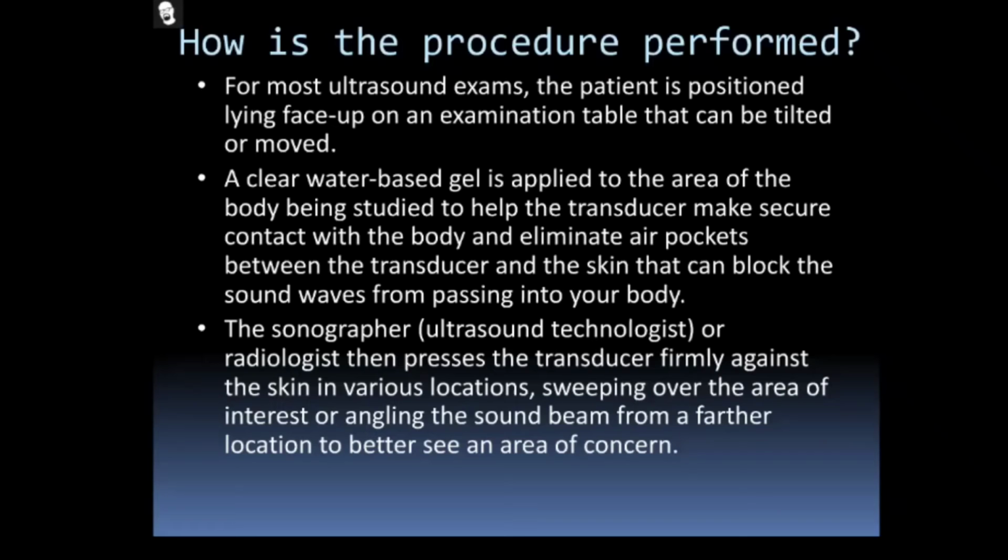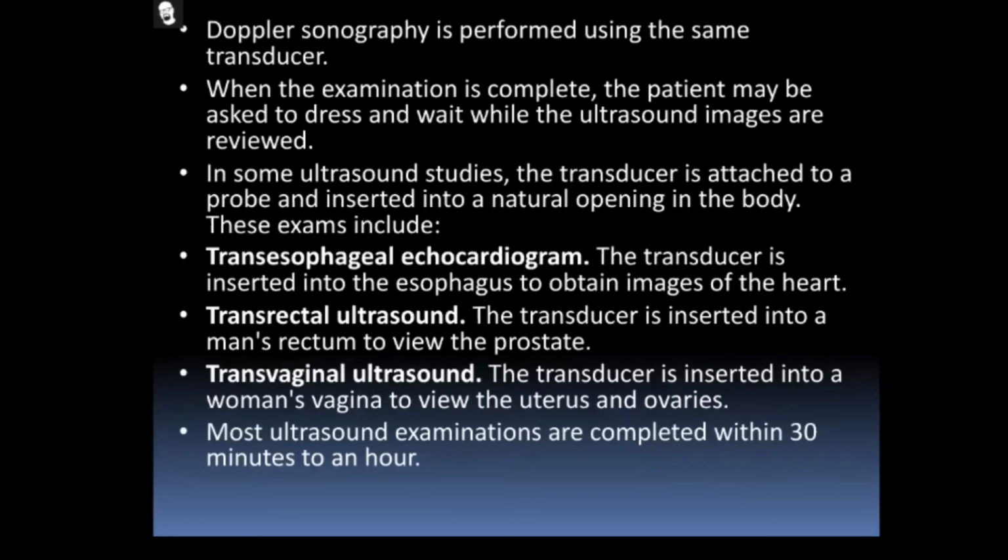Wherever the exact region you need, you need to keep the probe over that location. The probe can identify what internal organ is present there and what the condition of that internal organ is. All of it will be displayed on the monitor. That is what you need to note.